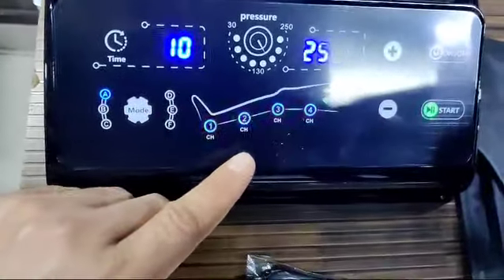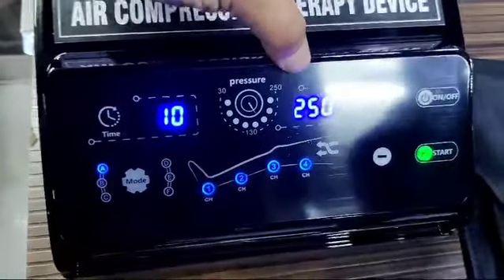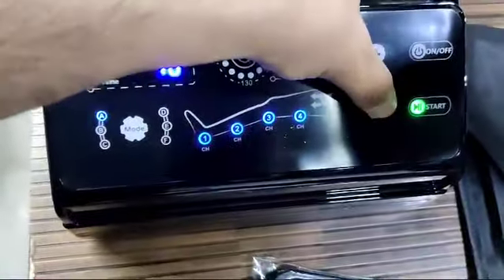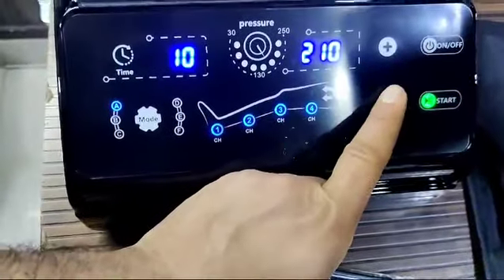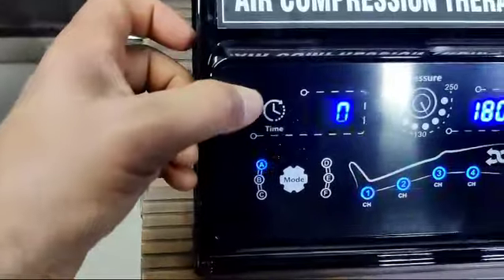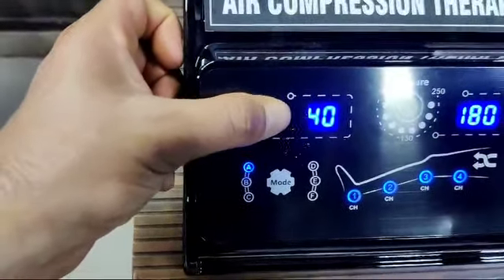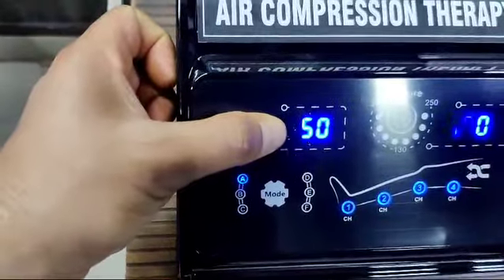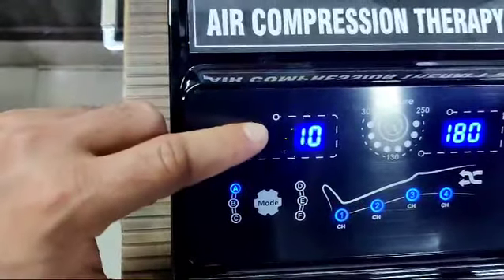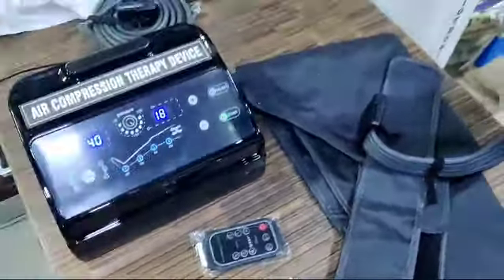Currently I am using all four chambers. This is the pressure range display: 30 to 250. You can increase or decrease the pressure from here. This is the time display — you can select multiples of 10 up to 60 minutes: 10, 20, 30, 40, or 60 minutes.